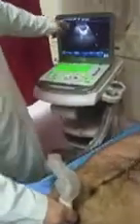I put my probe to the suprapubic area of the patient, probe marker towards the patient's right side, and the screen marker also towards my side, and I'm aiming my probe towards the patient's feet to see the bladder more clearly.